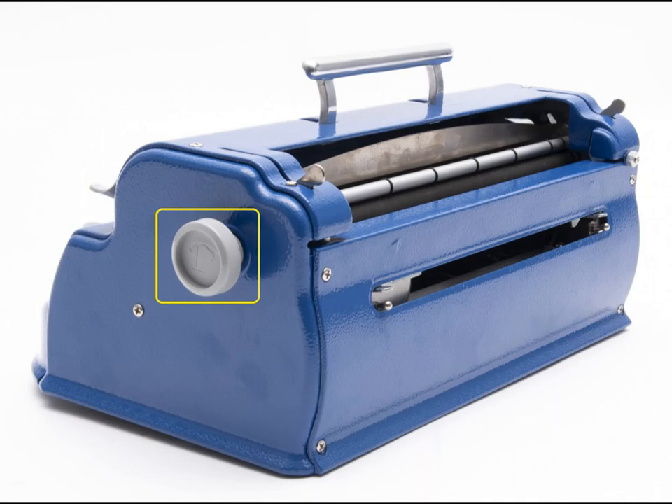The paper feed knobs project out from the left and right sides of the Brailler, and they are used for rolling paper into and out of the machine.